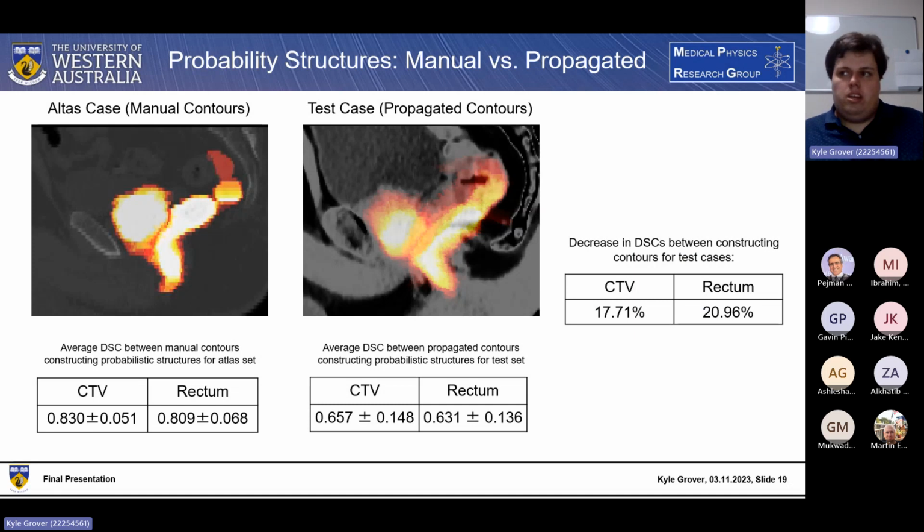Of note, even though we ended up having smaller volumes, as shown in the previous example comparing the propagated contours, they actually end up having pretty good coverage, and that's mostly due to where the exemplar contours originate. So the exemplar patients that were previously used with Angel's pipeline were selected because they could provide good enough variability so that when performing automated segmentation, they could do it very nicely with a very small amount of patient data being considered. Because of this, even though they have smaller volumes, they're spread enough to give good coverage of the total volume that would be considered a part of it.